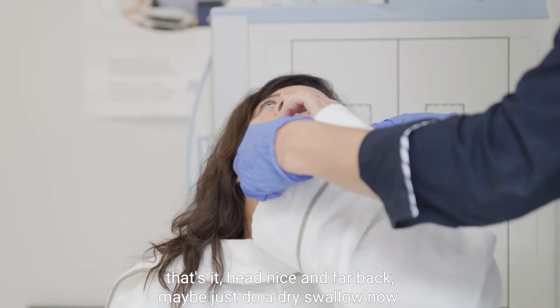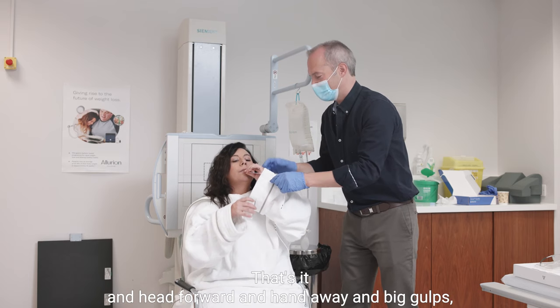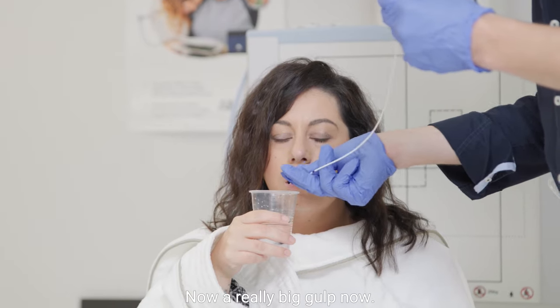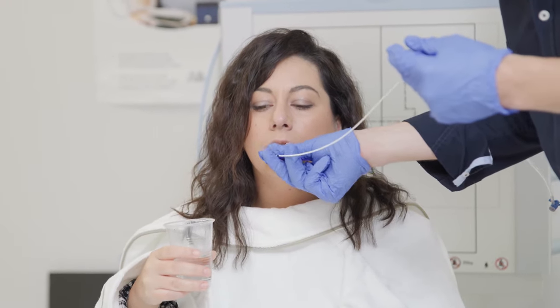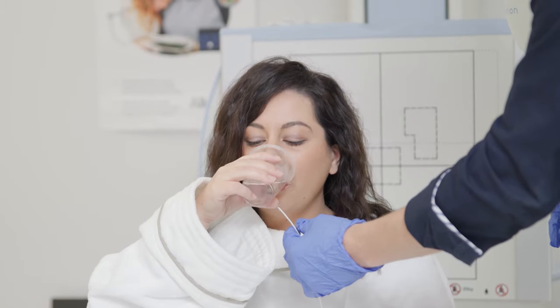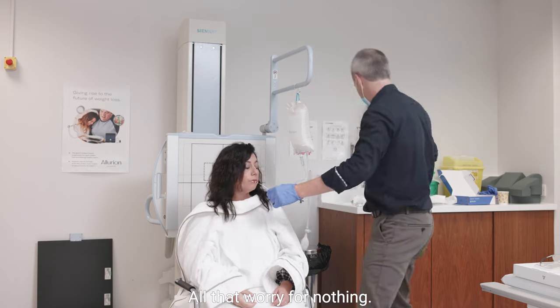That's it — head nice and far back, and maybe just do a dry swallow now. That's it. Head forward and hand away, big gulps, really big gulps. Now a really big gulp. We're almost there. One more gulp and we're done. What a superstar — you've done it! All that worry for nothing, yes?